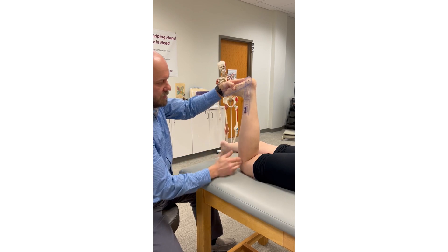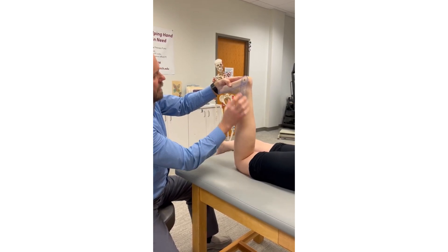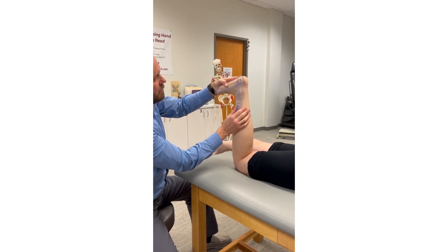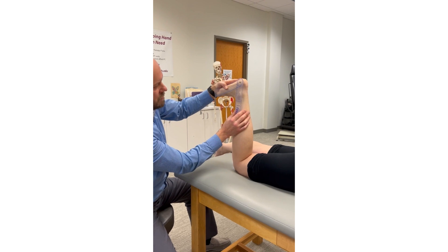The reference or proximal arm is going to be lined up with the lateral midline of the leg, and then our distal or indicator segment is going to be parallel with the lateral aspect of the fifth metatarsal.